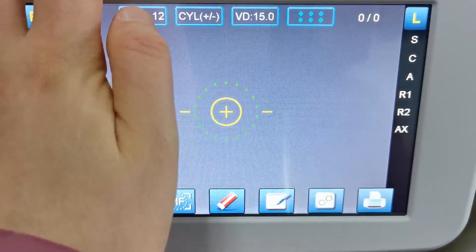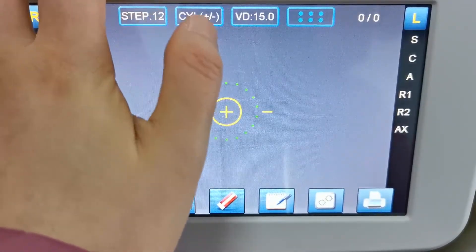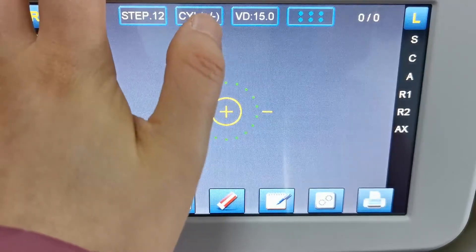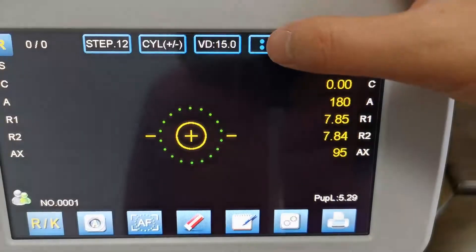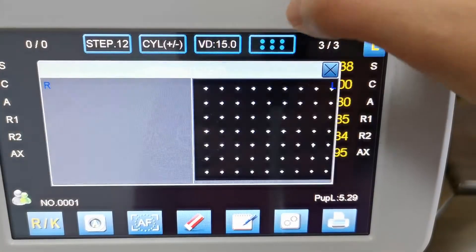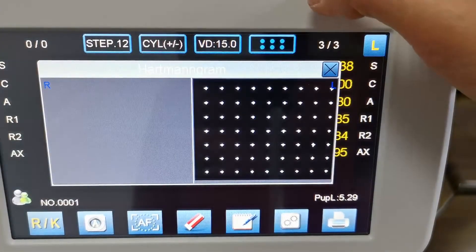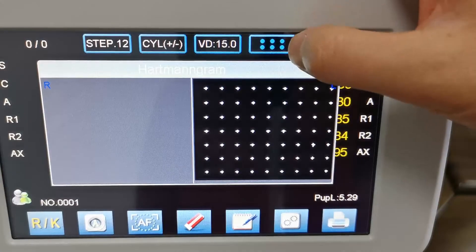15, and other options. And here is the menu to check the Hartmann array.